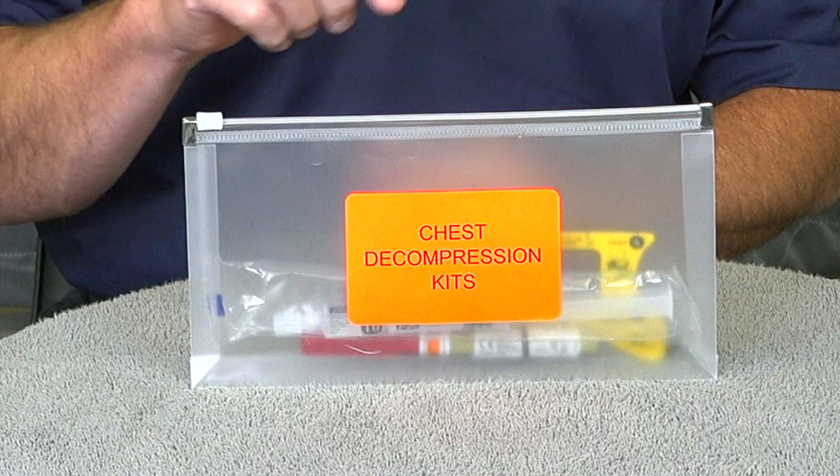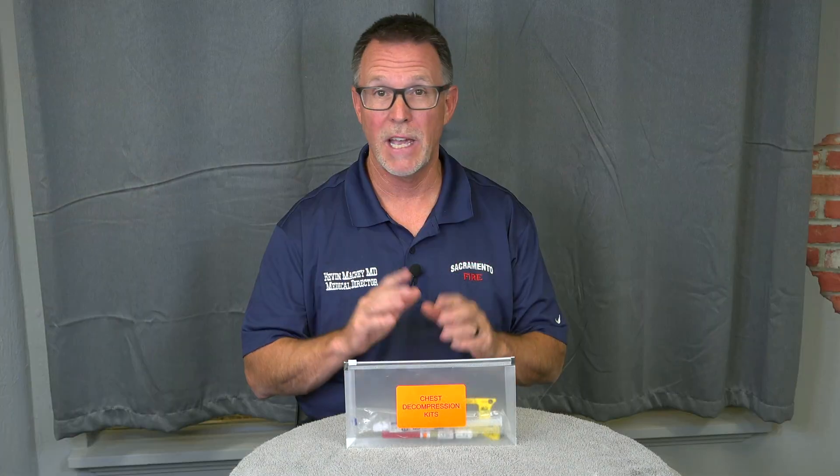Hey everybody, Doc Mackey coming at you with a little bit of training and some new equipment. This is a chest decompression kit. You guys all know that I start every video with a why.